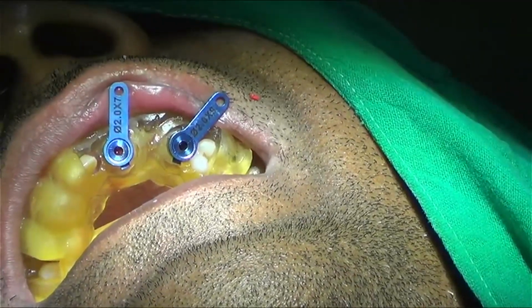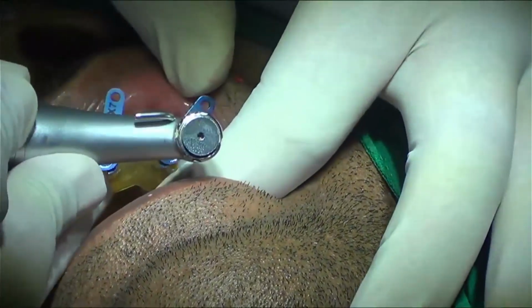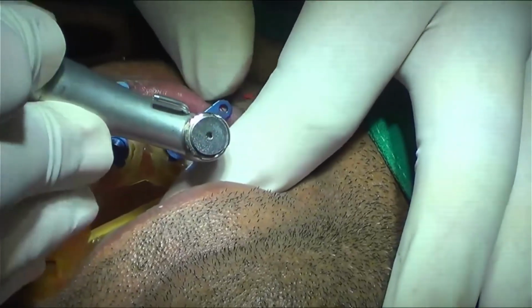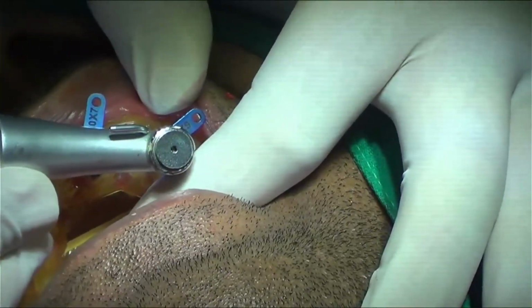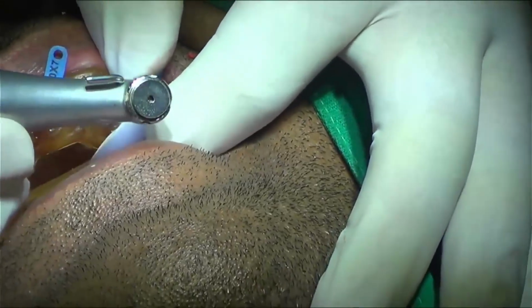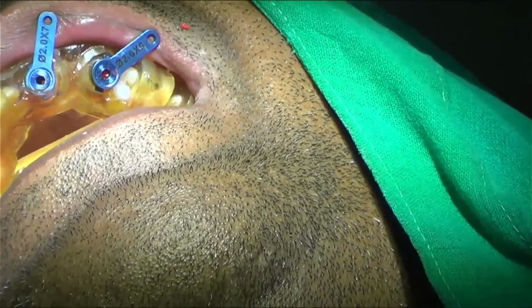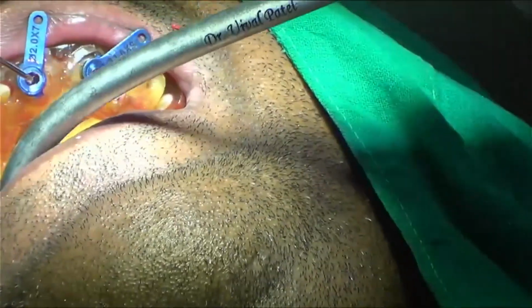You don't need to struggle with various pumping motions. Again, gone down, engaging the previous osteotomy, then drill and take it out. It's a very easy process once you know the protocol.